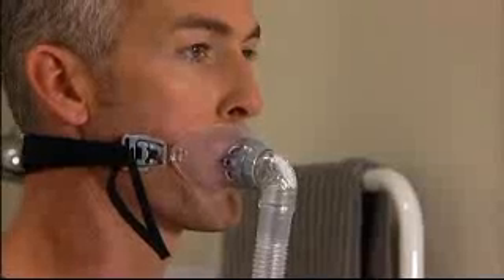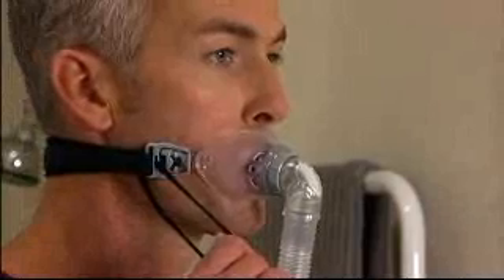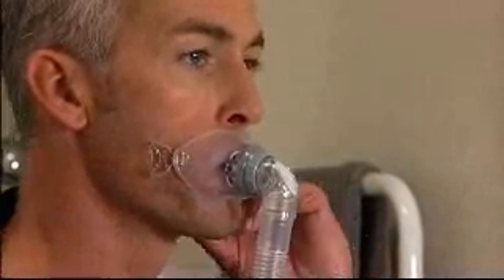To remove the mask, unhook the headgear from the glider strap by pulling the easy-release cord. Pull back the snap flap and remove the mask from your mouth.